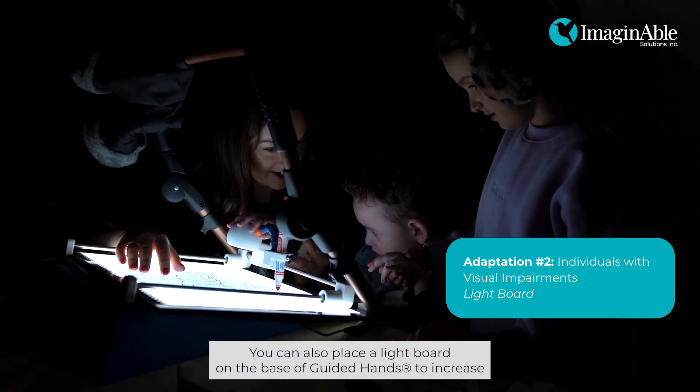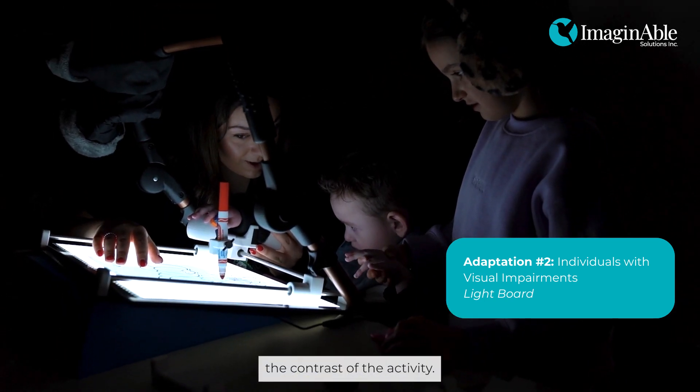You can also place a light board on the base of Guided Hands to increase the contrast of the activity.